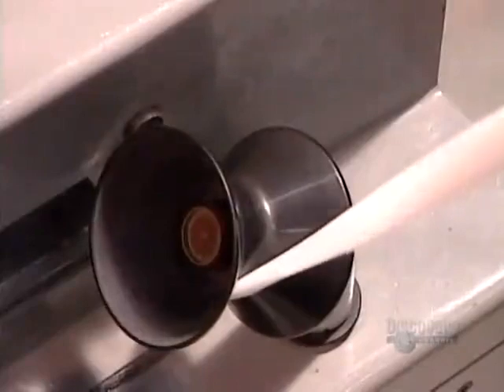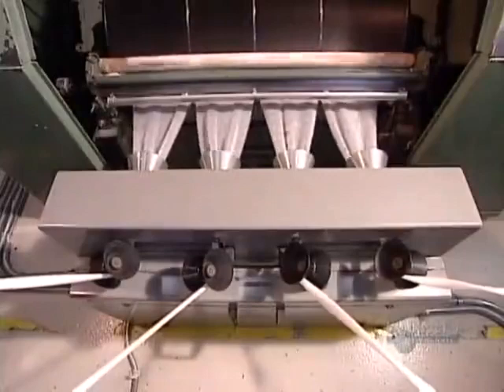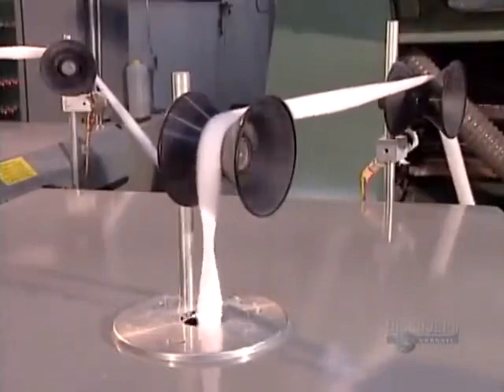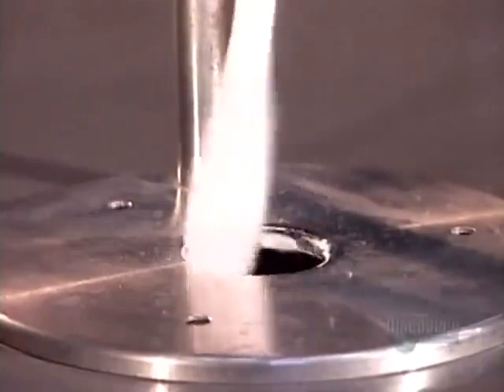To make cotton swabs, the initial web is divided into four narrower webs, each weighing 1.5 grams per meter. Each narrow web travels through a funnel, which transforms its shape from flat to round, and then it coils into a barrel.